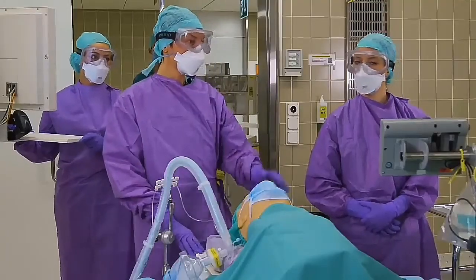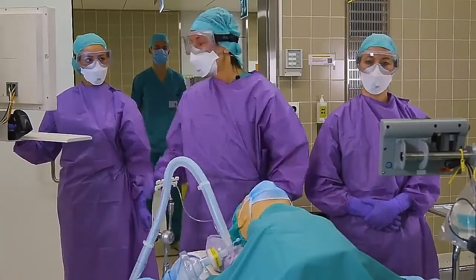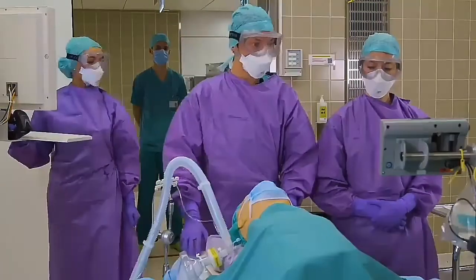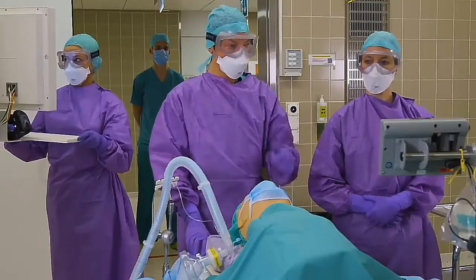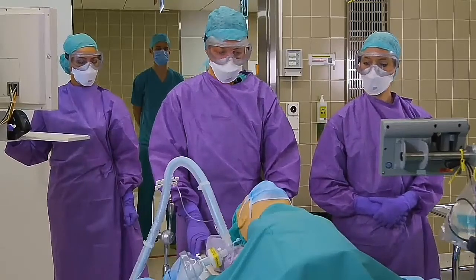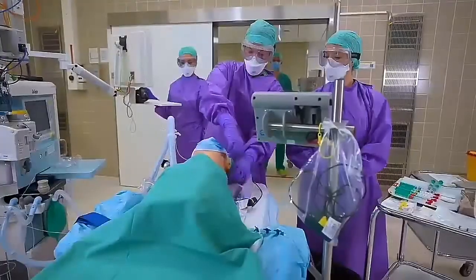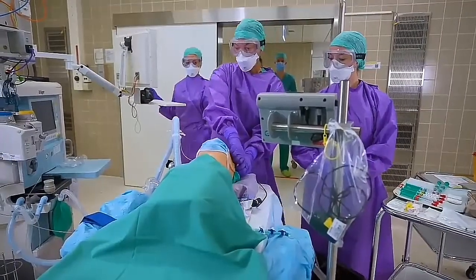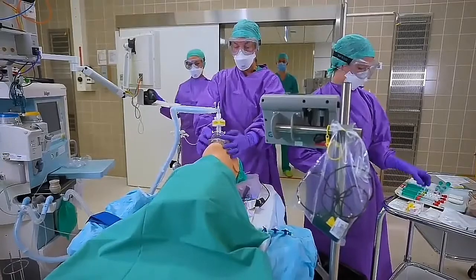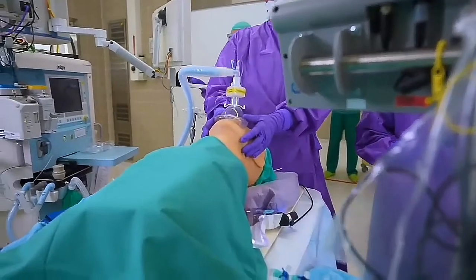We designated our roles clearly, with Larissa being the medication person and airway help, Manila doing the documentation, Tim outside as a clean person, and myself as a seasoned anesthesiologist doing the airway. We are starting with an adequate pre-oxygenation for about 3 to 5 minutes. As you can see, our patient is wearing a surgical face mask, which of course we have to take off. Then we will pre-oxygenate, and here it's important to have a tight-fitting mask to avoid any leakage.